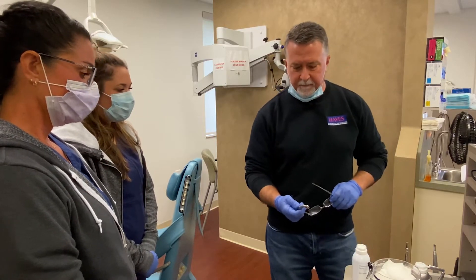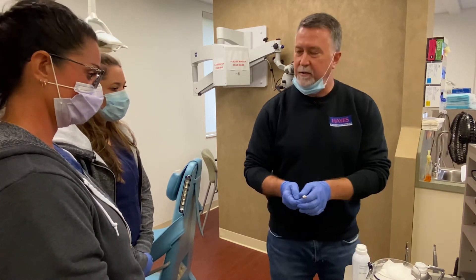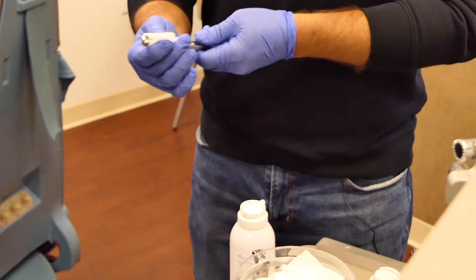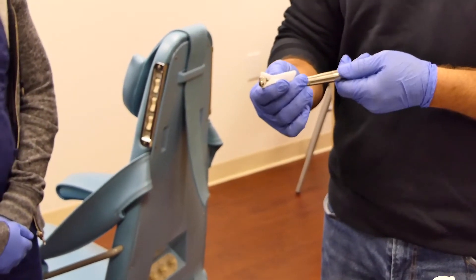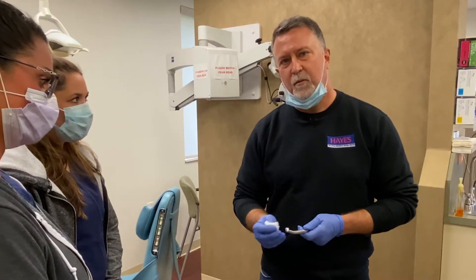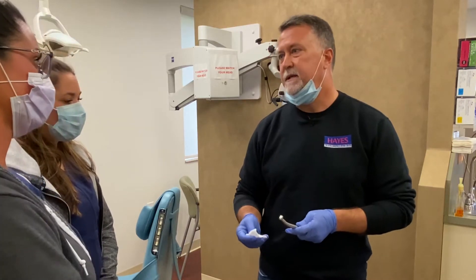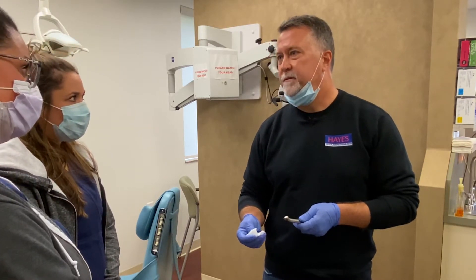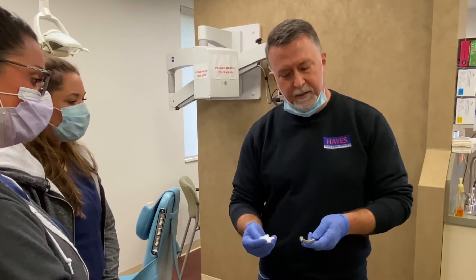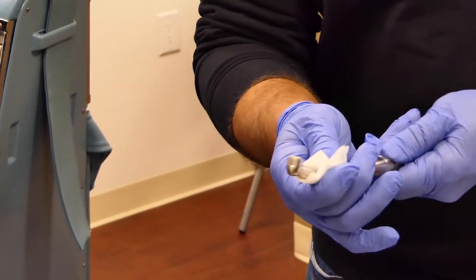With high-speed maintenance, after the procedure is done and you're getting ready to turn the room around, the first thing I'll do is take a two-by-two with rubbing alcohol and wipe the shell down to remove any blood, saliva, or tooth particles. I stay away from disinfectant wipes because the liquid in those wipes is very corrosive and tends to drift into the openings on the head of the handpiece. Since we're going to autoclave it, rubbing alcohol is all we need.